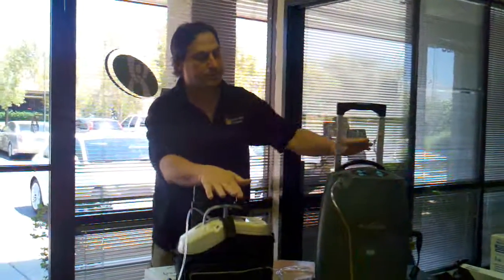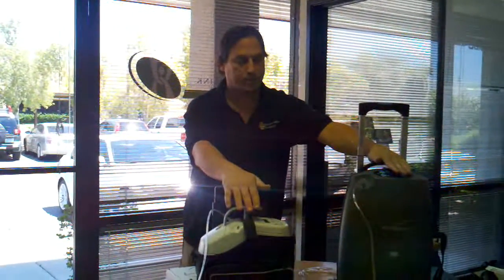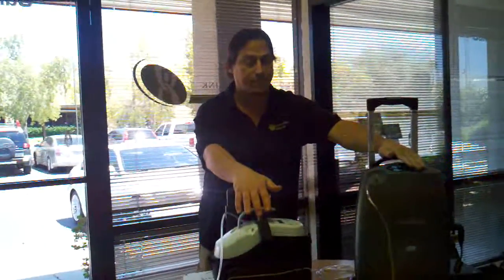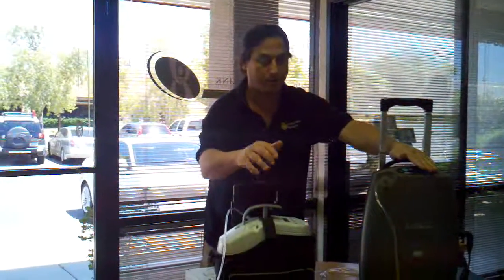This is a pulse dose. This is a continuous flow portable concentrator. You've got to know the differences before you decide which one to purchase. Contact us — we're here for you 24/7 if you have any questions. I just want to clarify these situations because we get calls all the time on this.